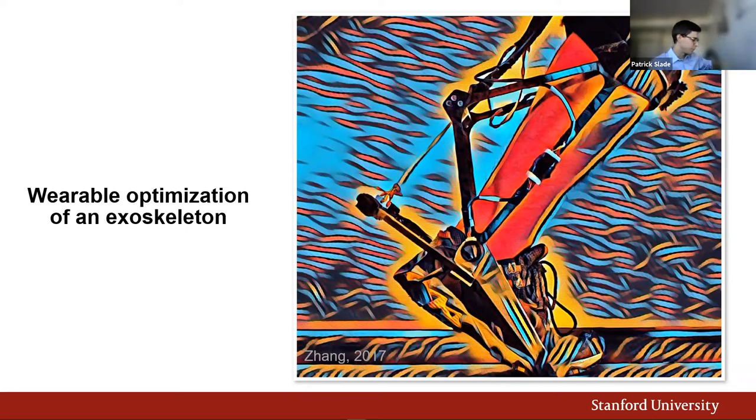I have a little prototype. If we were in person, I would have liked to wear it and demo it for you, but hopefully I can show you the basic principle. The idea is that you wear this on your leg, and by applying some force to the cable, you can actuate the foot and provide a push-off assistance.